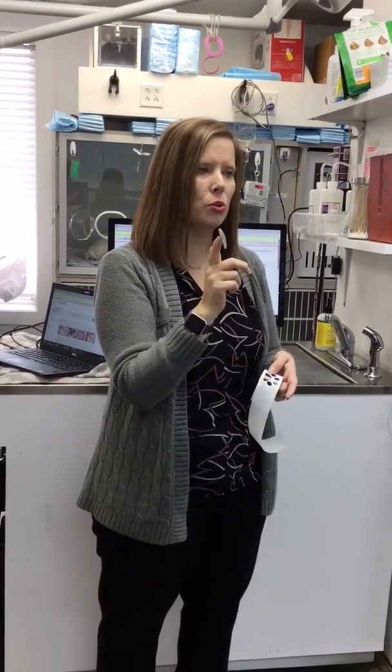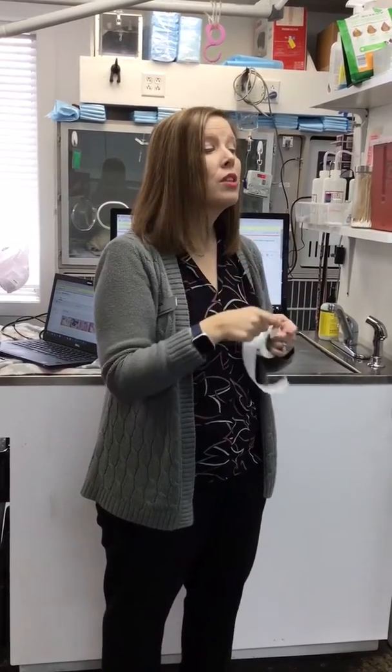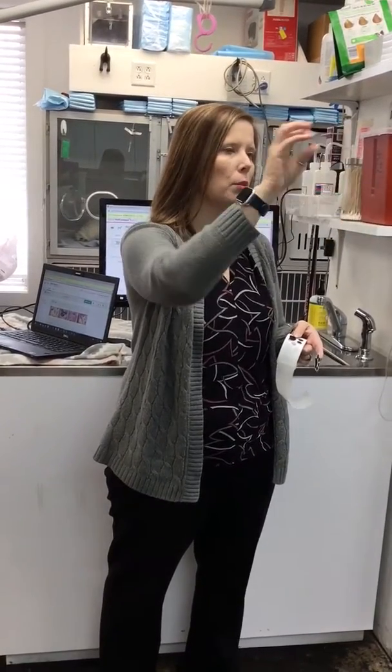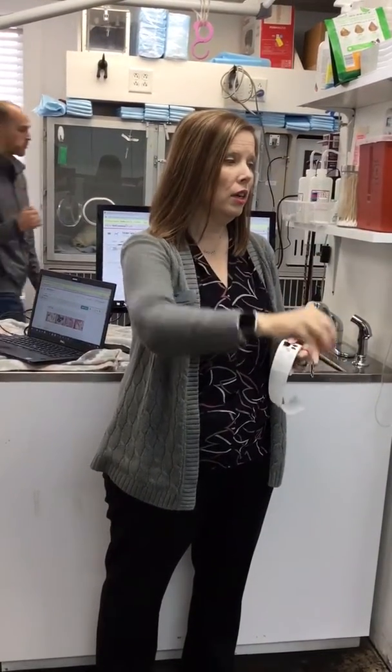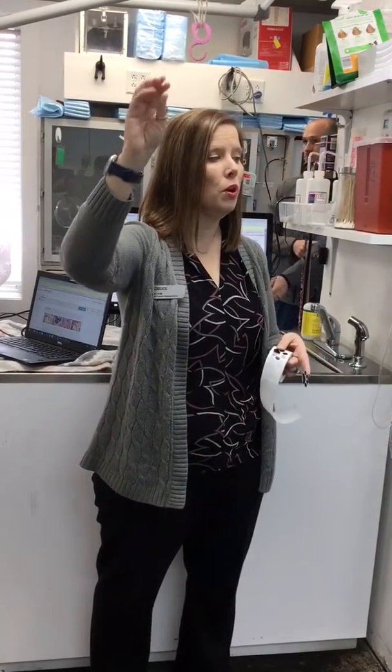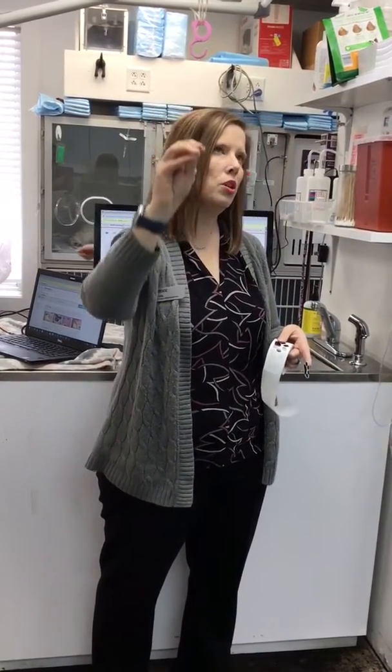You know how you say add test, you pick the SediVue, and then it asks you if you want to append the results, merge and replace, add new, or cancel. Y'all have seen that, right? Which one should you choose? If you select add test and select the SediVue, it's going to ask how you want your results. Do you want to append them? Do you want to merge and replace? Do you want new, or cancel?